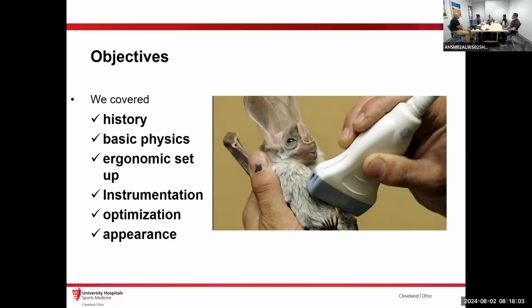By floating the probe, I mean putting a bunch of gel down and then not pushing it all through when you push down. So you really have to kind of float the probe over top if you're using the linear one. With a hockey stick, you can use less gel and you have a smaller footprint, but you still have the frequency to be able to see those superficial structures and you can get to them. So it's much easier to do a median nerve with a hockey stick because you don't have this covering the whole thing, right? So the only difference between a hockey stick and the linear to me is the footprint.